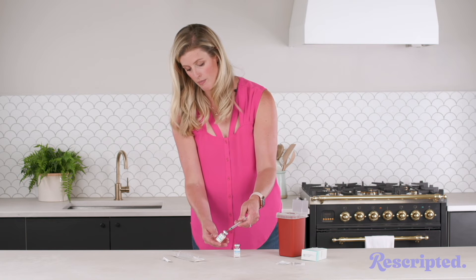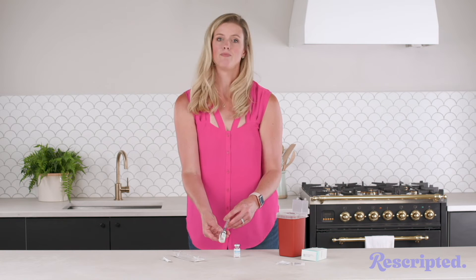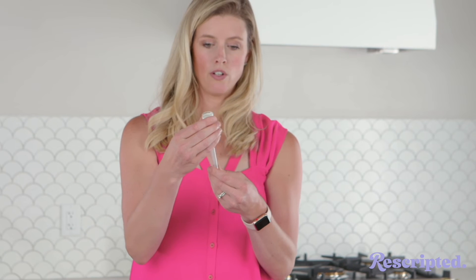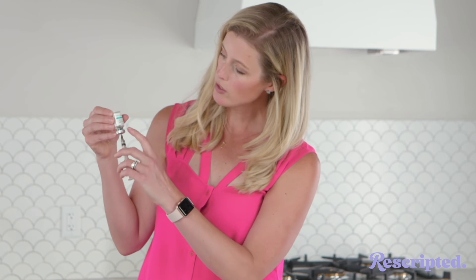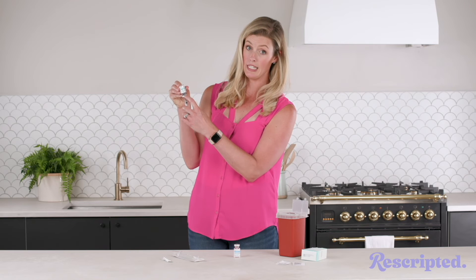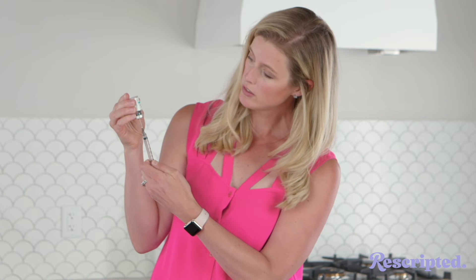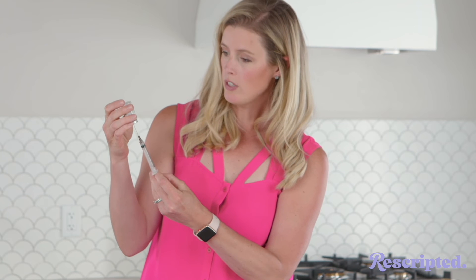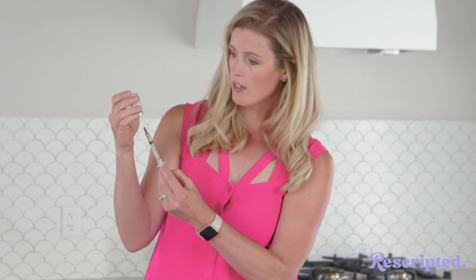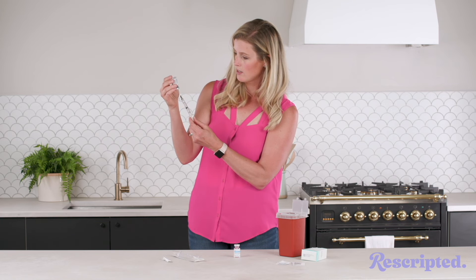Once the powder is dissolved, bring the vial up to eye level. You're gonna look for the little window — it's gray all around except for a little window where you can actually see the liquid all the way to the bottom. Now pull the needle all the way out until it feels like it's about to fall out but not quite, and look through the window as you draw back, trying to get every last little drop of that medication.